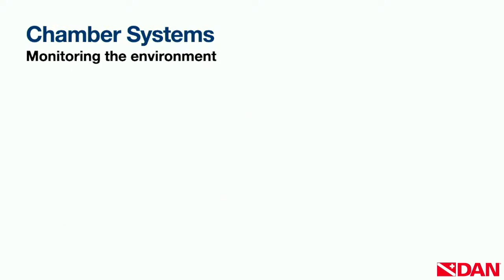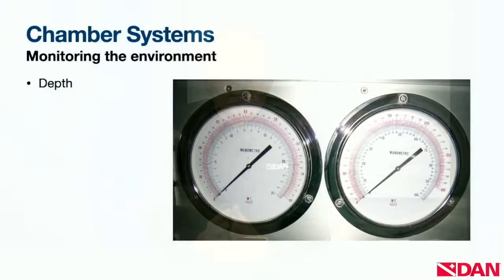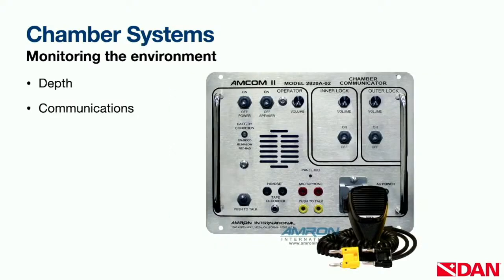We have the chamber pressure, we're giving the medication. A couple of things we need to take care of during the treatment. The first is the depth. We don't use one of these relatively inexpensive, difficult to read depth gauges we use when we're diving. These are very accurate, calibrated gauges that give us very fine increments so that we can get the diver to the right pressure, keep them there, and then gradually bring the pressure down at a very controlled rate. So they are nice and big, easy to read, but very high-tech gauges.